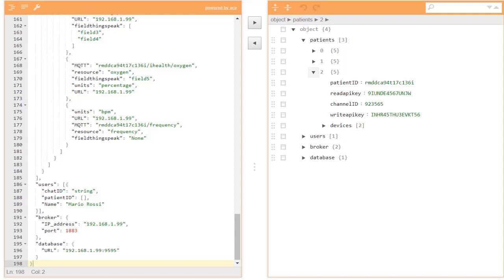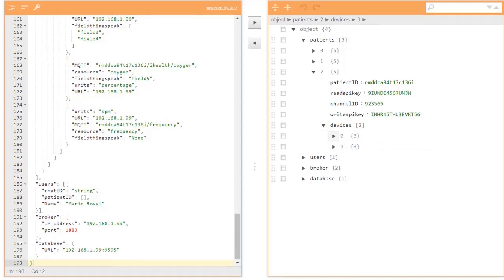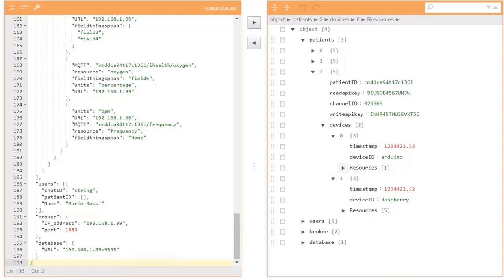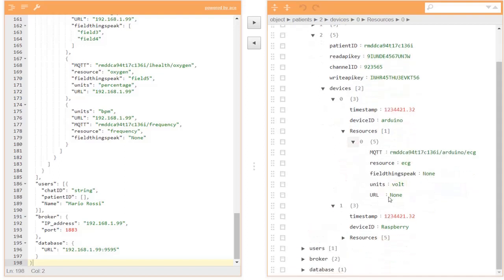Every patient has also a list of devices connected to him. In this case, the devices are Arduino and Raspberry. Both Arduino and Raspberry have a timestamp, a device ID, and the resources related to them. Arduino has only one resource. Each resource has the MQTT topic, the name of the resource, the field in ThingSpeak, the units of the resource, and the URL related to the resource.